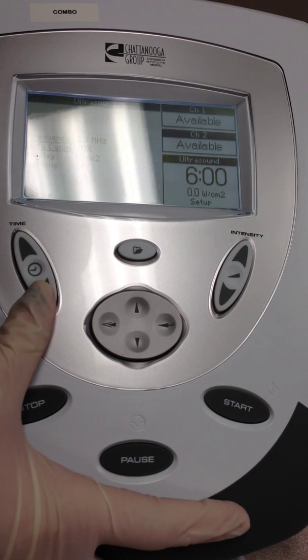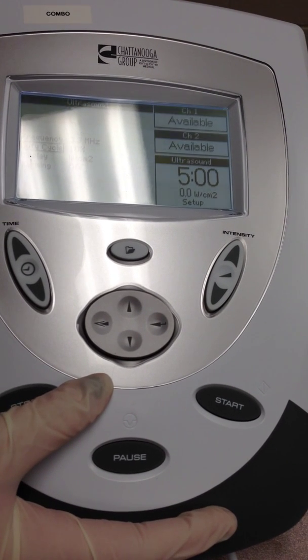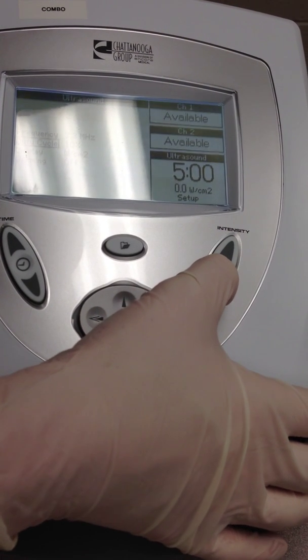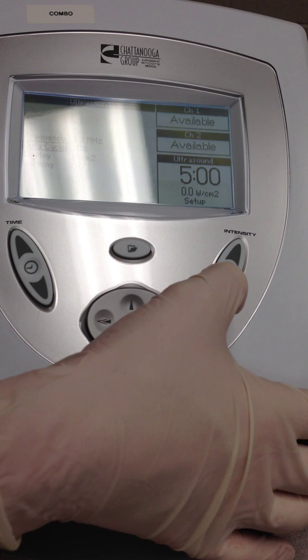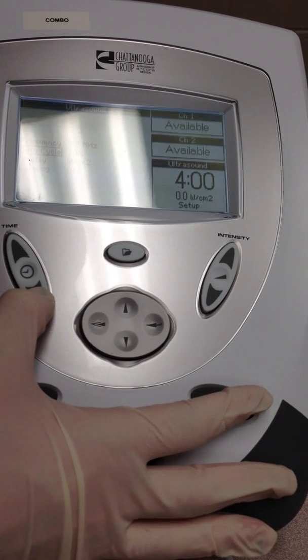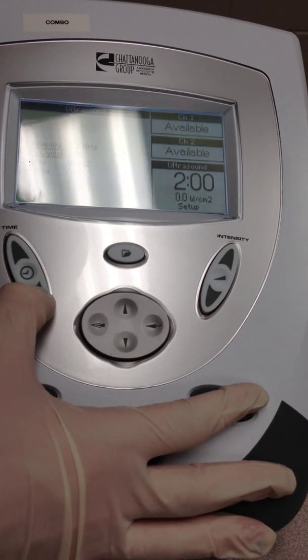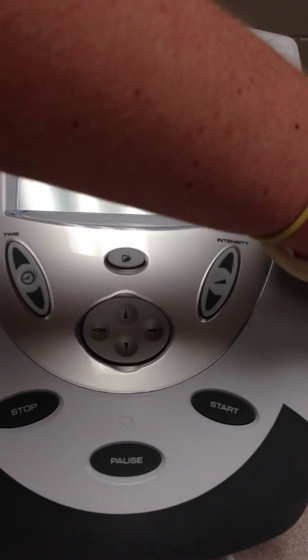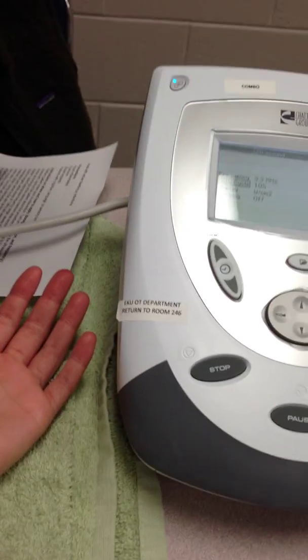I'm going to set the time to 5 minutes. And we'll go down to 1 minute here. We already have the medication in the gel.